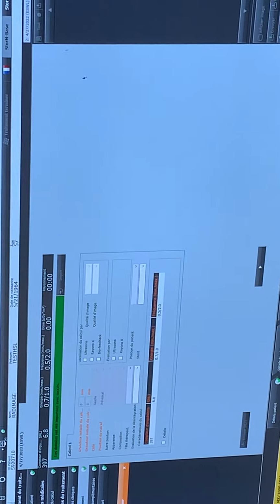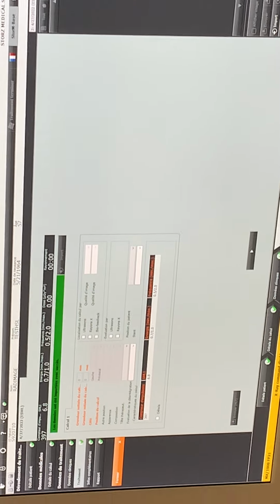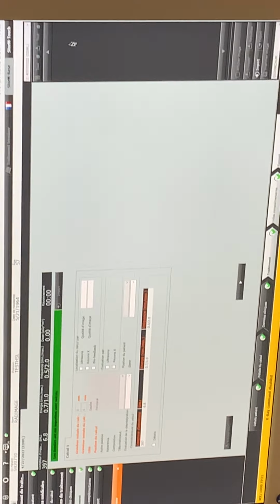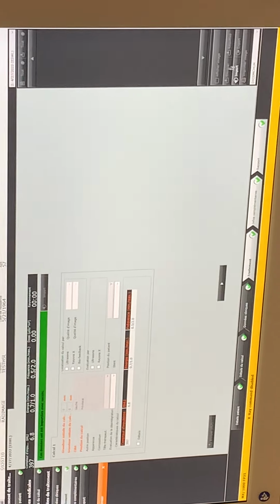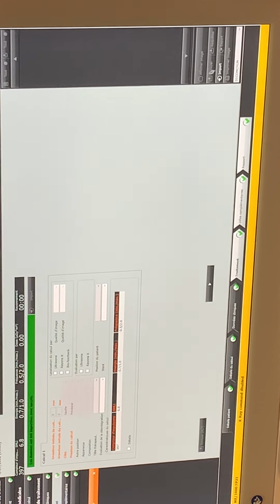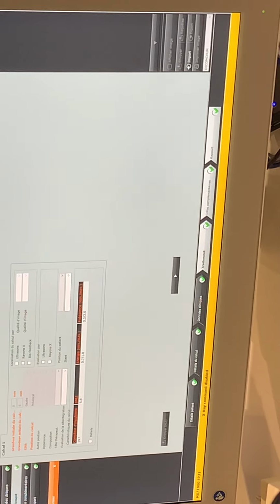You will see here now we have some information about the energy, about the frequency, about the dose, about the X-rays, and so on. Normally we would have here a lot of images. With this button, you will send it to your PACS system. Send button.